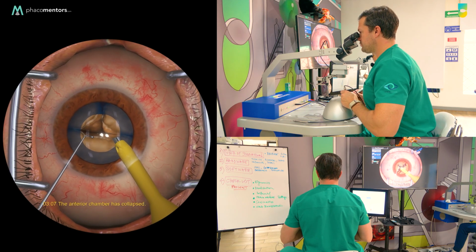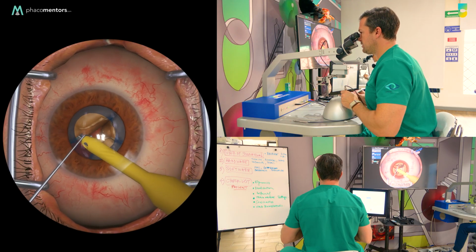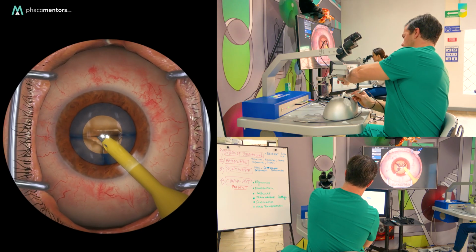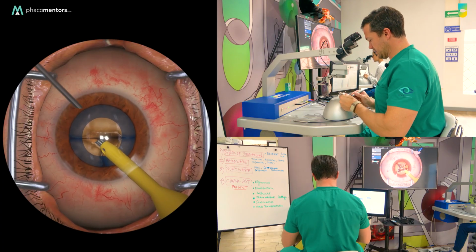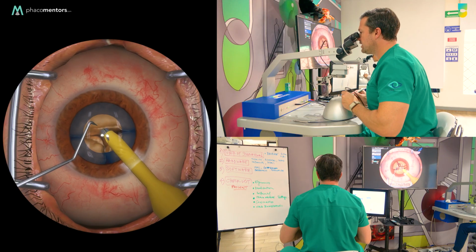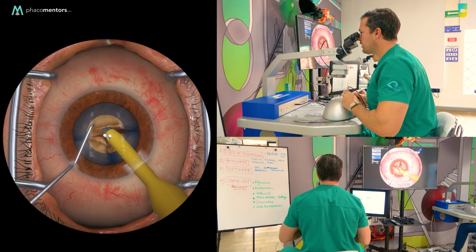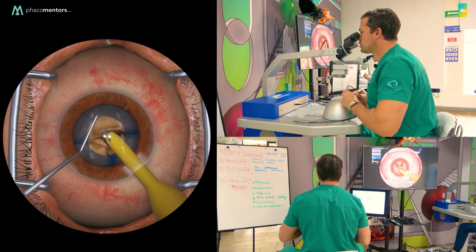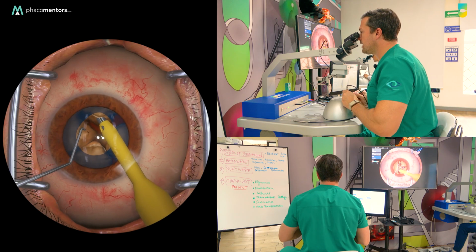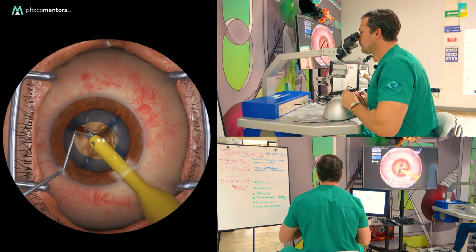I had a collapse of the anterior chamber. Well, careful. This is a very dynamic environment, very important. Again, position 1. I can change my second instrument, and now suddenly I can do vertical chop, which is a very difficult technique too. I go, look, to the nucleus, 2, 3, 2, high vacuum, and now the chop is going to be in a vertical axis mostly, bang, and look at that, fantastic vertical chop. Being very careful not to traction the zonule in the periphery.